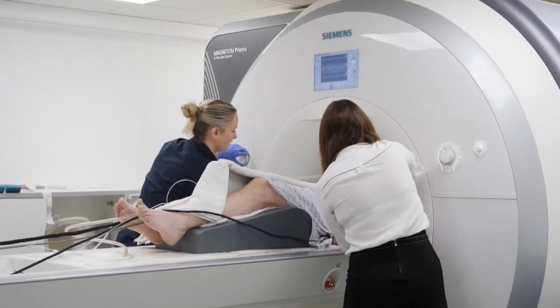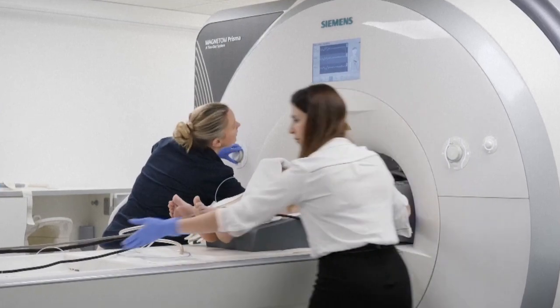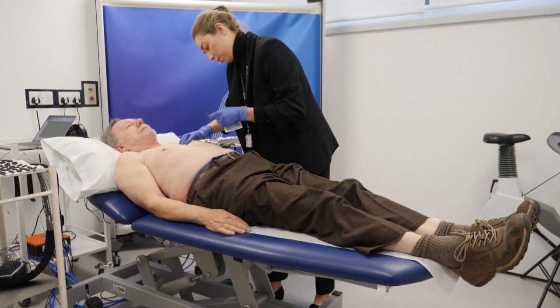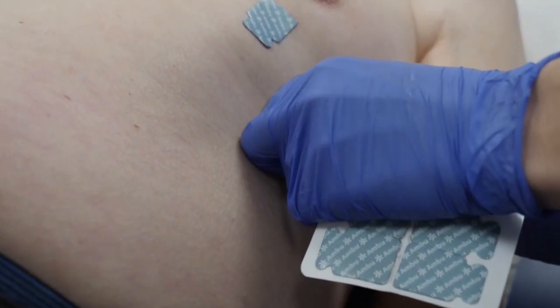There's no feeling at all, really, I suppose. I mean, you obviously feel you're lying on something, so you've got that little pricks, I suppose, on the back you can feel. And then when it's pumped up, you can feel the pressure of that. But it's not uncomfortable at all. That's in contrast to this procedure he's undertaking here, the ECG, which isn't invasive but can be uncomfortable and produce excessive sweat.